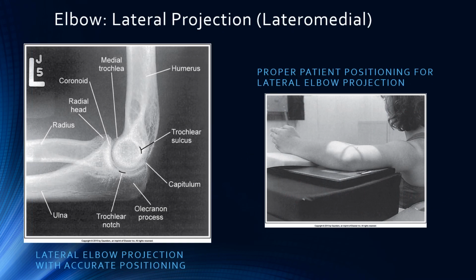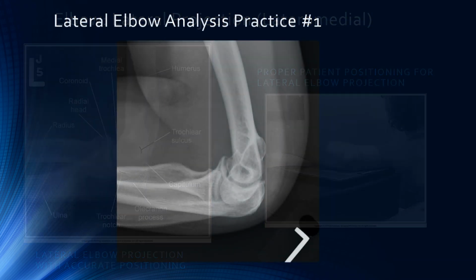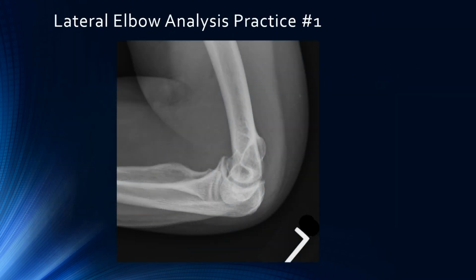Elbow lateral projection, lateromedial. Here are two excellent examples of the lateral elbow in perfect, accurate positioning. You want to center mid elbow. Lateral elbow analysis practice number 1.